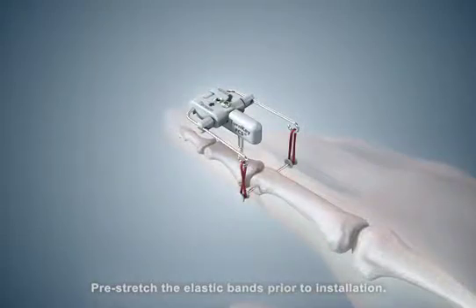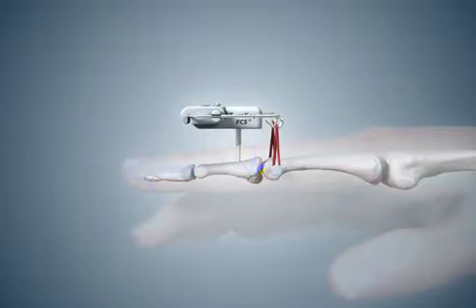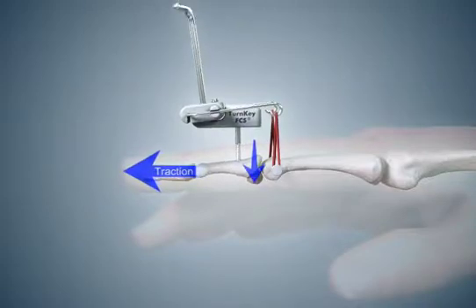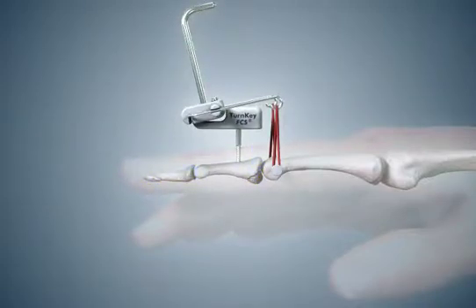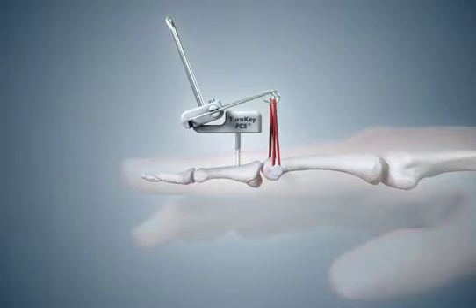After the pin placement guide was removed, joint subluxation most likely recurred. Use longitudinal traction to prevent damage to the cartilage of the proximal phalanx as the middle phalanx realigns. Evaluate if the initial elastic band tension is sufficient to maintain joint reduction. If not, reapply manual traction while increasing elastic band tension by rotating the tension adjust screw clockwise with the hex wrench. Use the least amount of tension necessary to hold the middle phalanx reduced, as excessive translating force can damage the collateral ligaments and may result in a palmar dislocation of the joint.